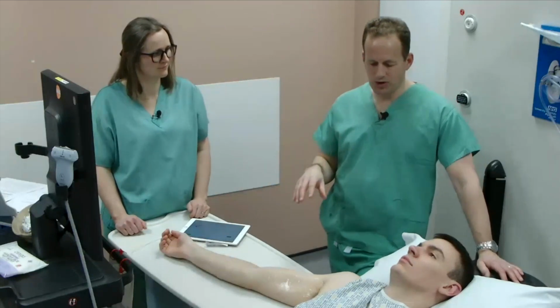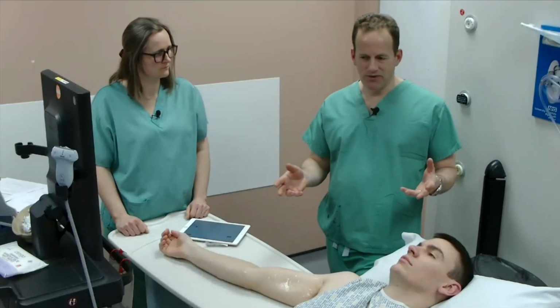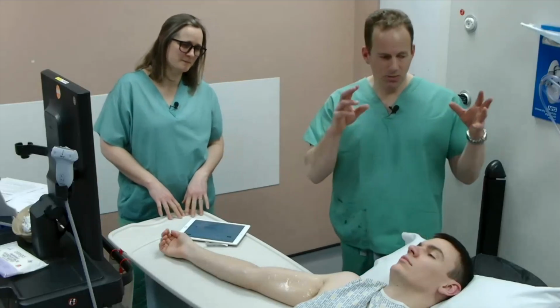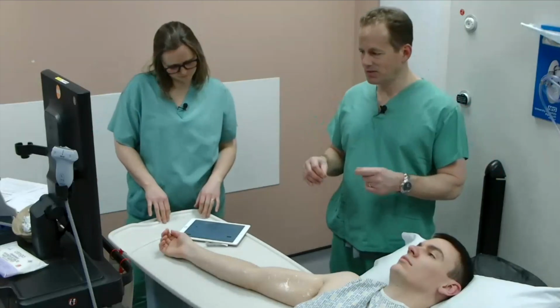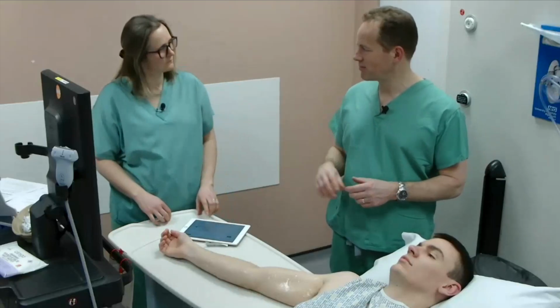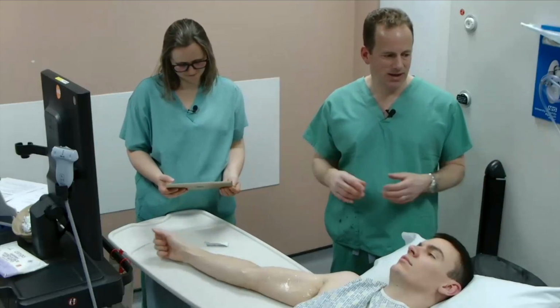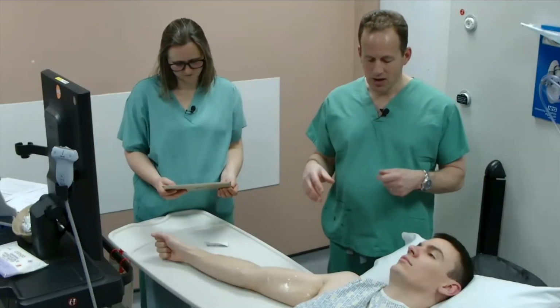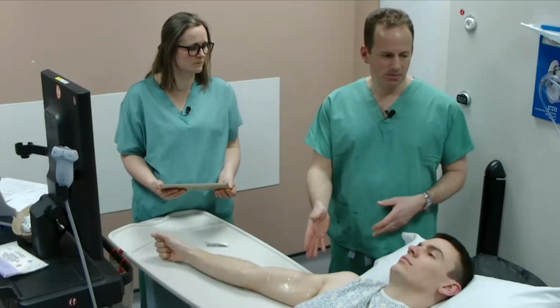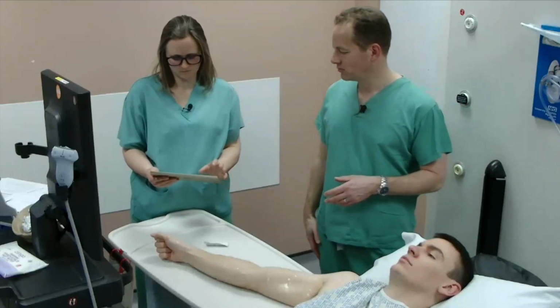I take all of the monitors off to take them round, providing everything is fine, and sit them up first, just to make sure they're not going to collapse on you. But otherwise, they will be monitored. If you take them around with a load of monitors on, nurses, no offence, like to monitor and to write things down, and they will chart more blood pressures forever. And the patient won't go home, and an hour later you'll go back to see them and they're still sat there hooked up. So I take them out, provided they haven't had sedation, or any more sedation than maybe just a couple of midazolam an hour ago at the start of the block. So that's our kind of local rules.